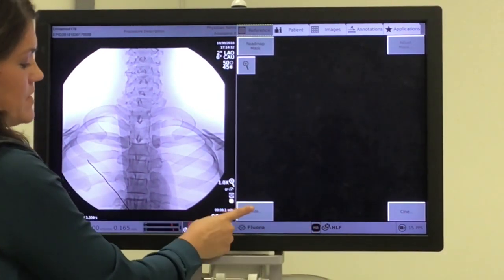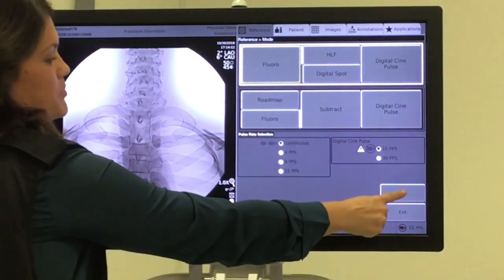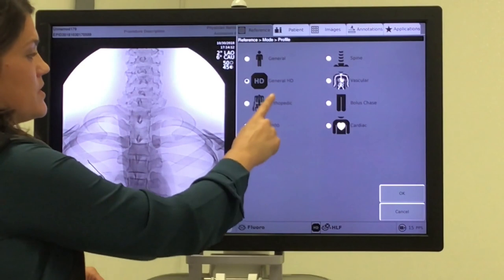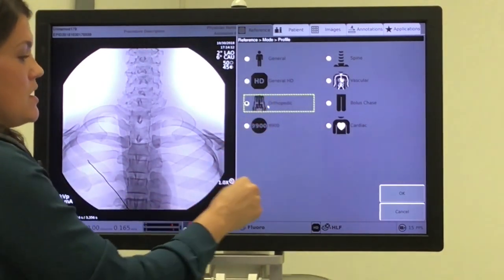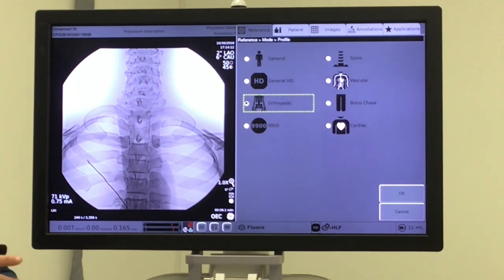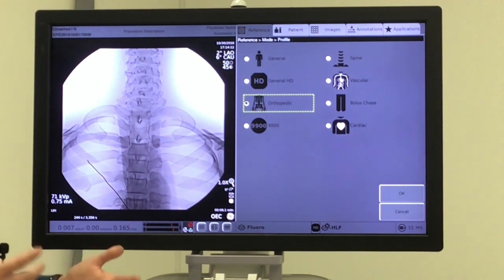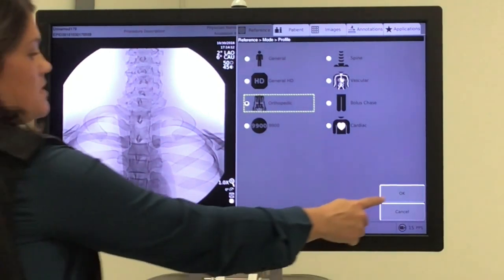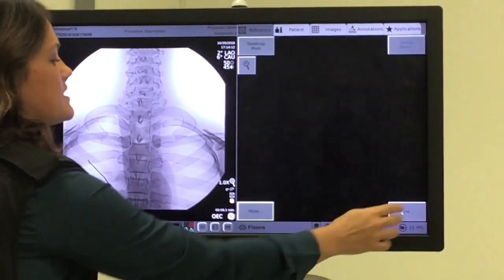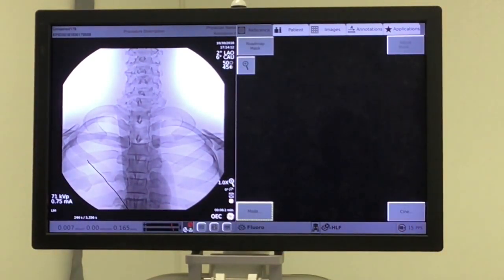Next, let's try a different way — let's hit Mode, click Profiles, remembering there are three different ways to get to profiles, and we're going to select Orthopedic. Orthopedic is basically what it sounds like — it's going to be for orthopedic work. It's very black and white, not a lot of emphasis on soft tissue, but that's the goal. We hit OK, see our icon change, and take an orthopedic picture.